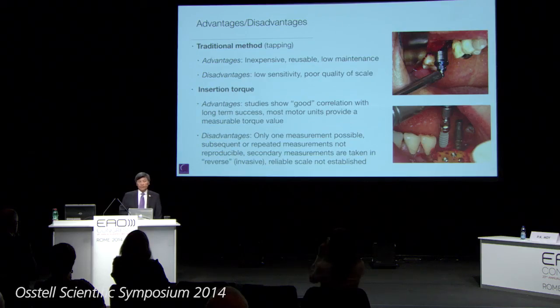You can take the implant out again and insert it again to take another measurement, but how many of you take another insertion torque measurement once the implant has healed? Do you remove the implant? Do you use reverse torque? How many of you have experienced this effect when the implant hasn't integrated and you put the reverse torque on it and you peel your patient from the ceiling?